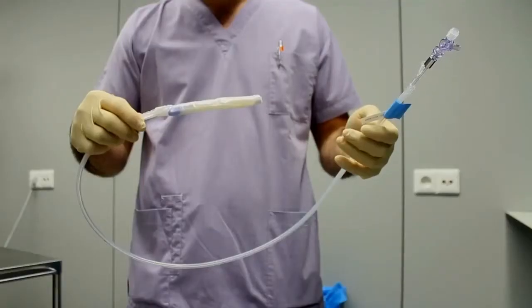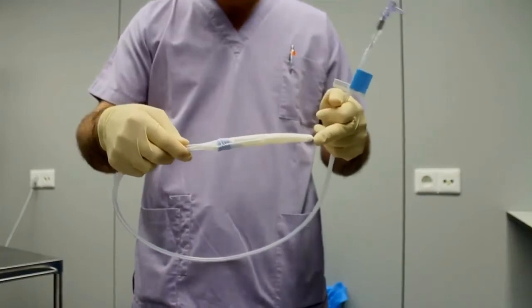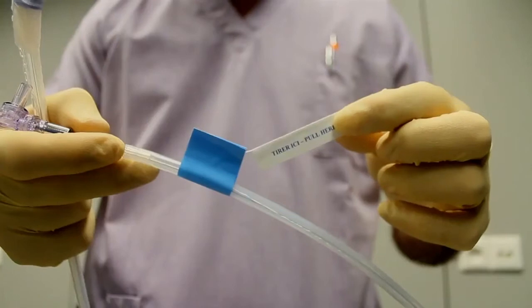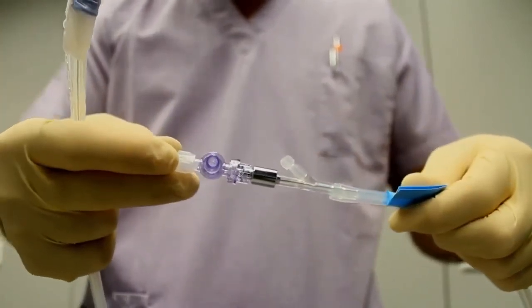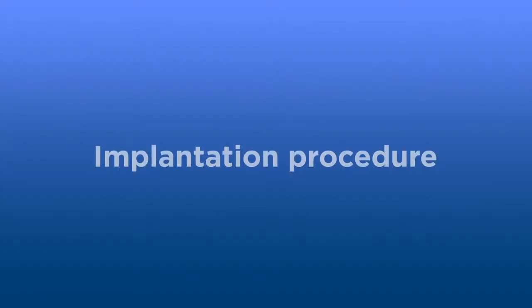The Heliosphere NewTek Kit. This system includes one radio-opaque intragastric air-filled balloon with a triple-layered polymer pouch covered with a silicone envelope. The balloon, in its protective cover, is accompanied by an introduction kit, which is pre-connected to the balloon, as well as a 60 cubic centimeter syringe. Both together are used to fill the balloon.